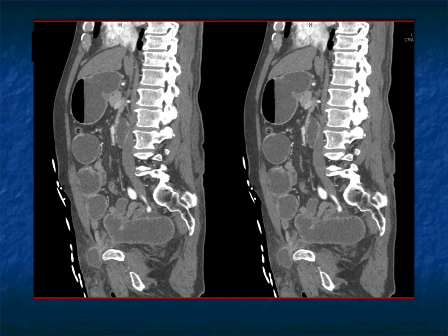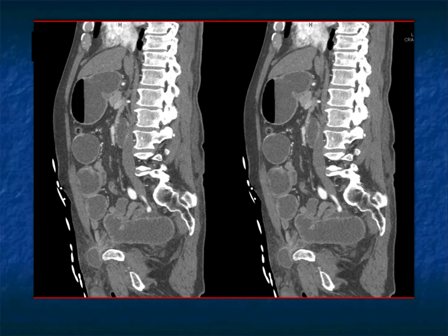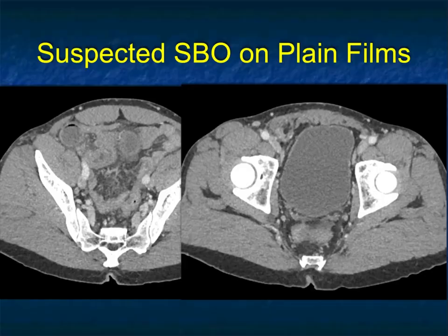The sagittal views also nicely show the hernia here as well. When you're looking at hernias, you're looking for transitions. Axials are good as a starter — maybe you see the obstruction — but coronals are critical, and sagittals are critical also for helping define the hernia, but also for giving you a good look at the SMA and celiac axis to make sure there are no problems going on there.